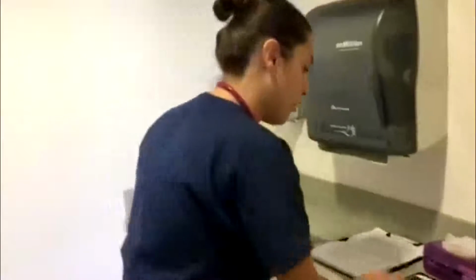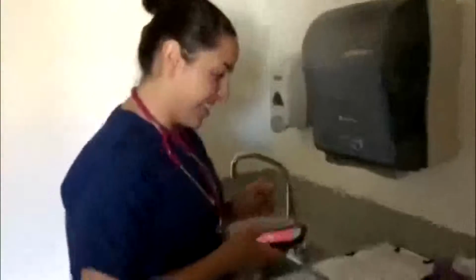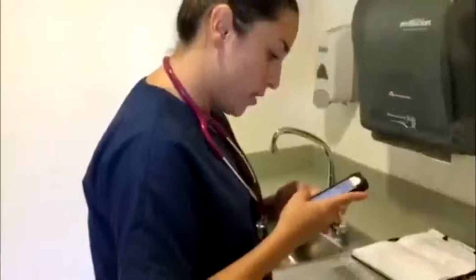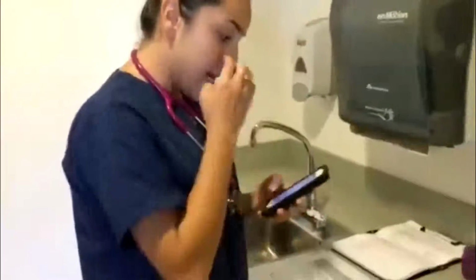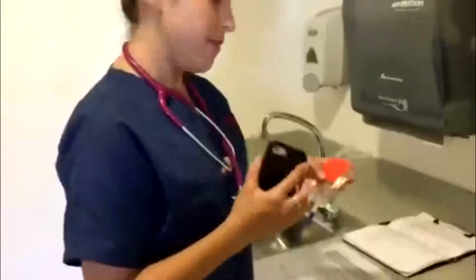Okay. So at this point, I want to verify my calculations on Skyscape, make sure that both medications are compatible with one another, and that my calculations are correct. Okay, so for Zosyn, it says that for a normal adult, the medication should be administered over a span of 30 minutes every 6 hours.